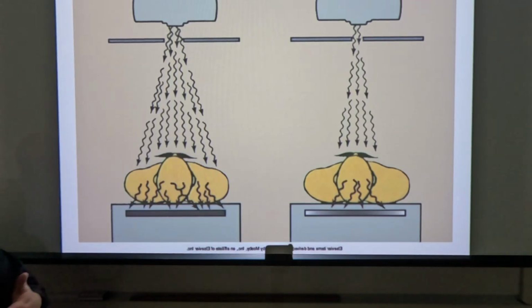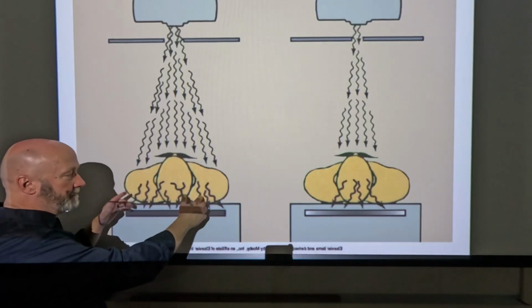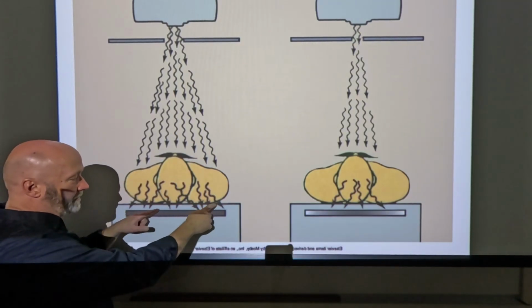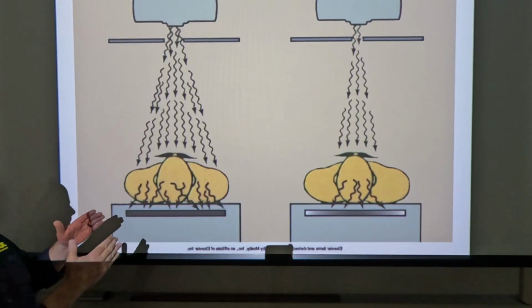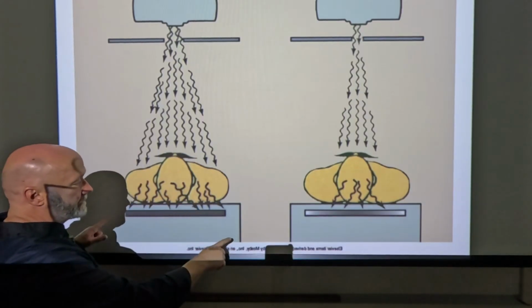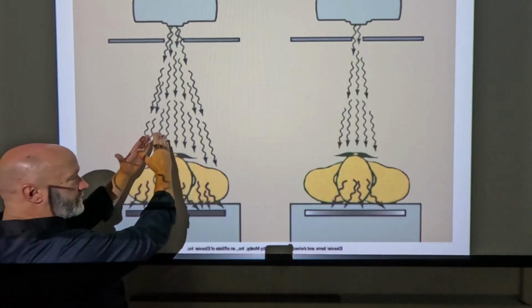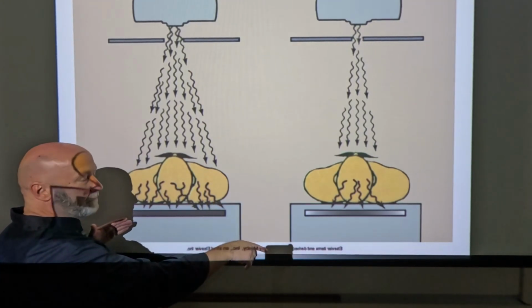You didn't bend those x-ray photons to focus on that one spot. Does that make sense? Okay, so the other thing is also this. If you block this radiation, you collimate in, you see where all this scatter radiation is going, and the misrepresentation is that the scatter radiation is kind of following the divergence of the central ray, right? So divergence is coming down like this, scatter radiation is created and it goes out at a wider angle.